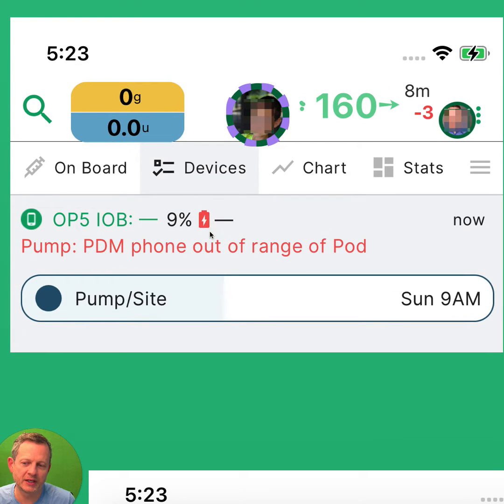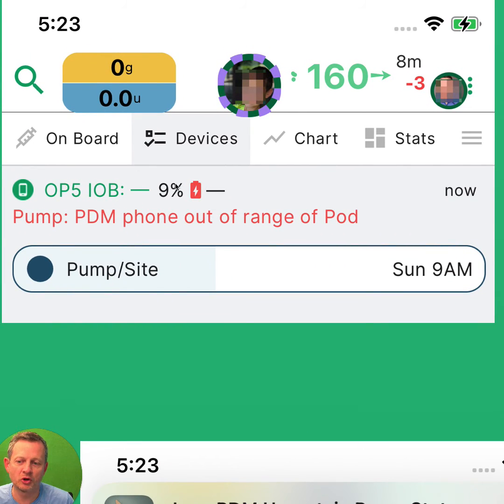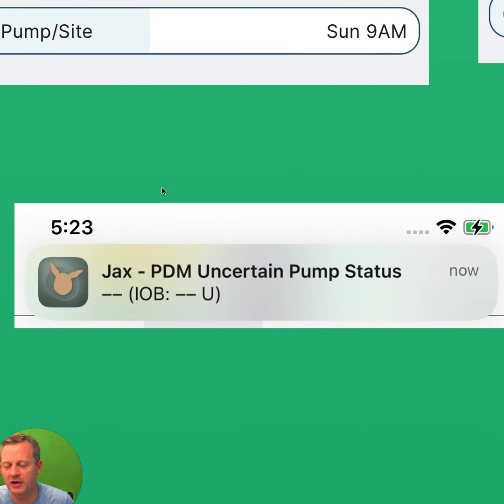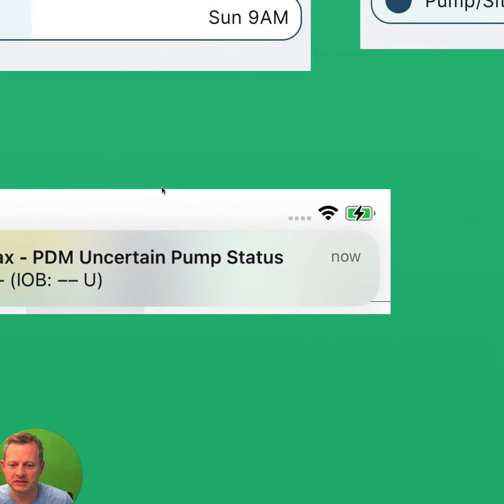Here you can see, for example, that the PDM phone — the compatible smartphone, not the original PDM device sent to you by Insulet — is plugged in but with only 9% battery. You'll get notifications too on iOS that look something like this, to remind you to plug in or to warn you of an uncertain pump status and so forth.